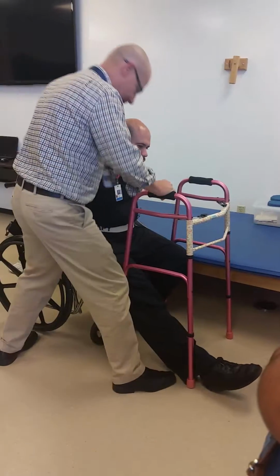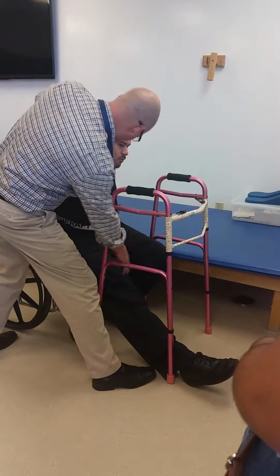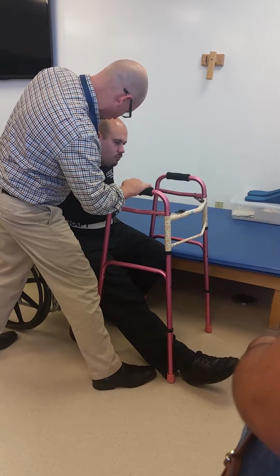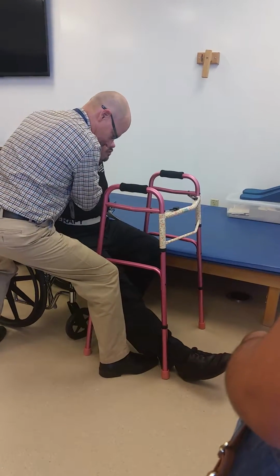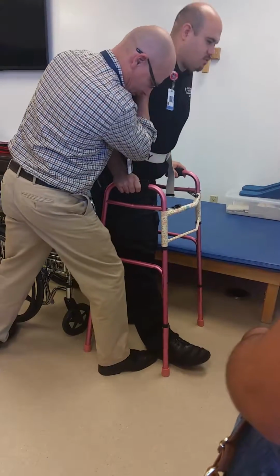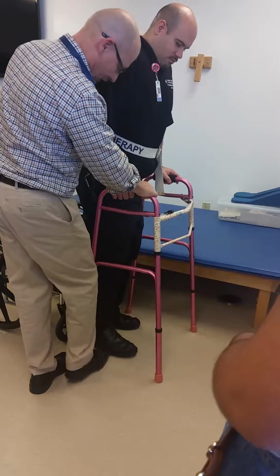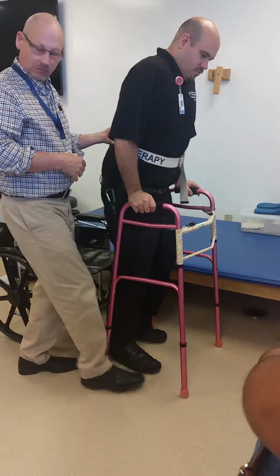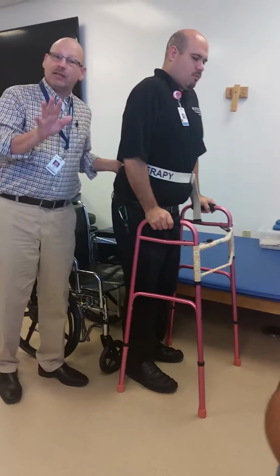I've got a wide base of support. I'm bent low, okay? So on 3, Randy, you're going to lean forward. You're going to stand up, and then you're going to bring this leg underneath you. You're going to put your hands on the walker. You ready? All right, on 3. 1, 2, 3. Good. Bring your leg underneath you. Now, I think I blocked you, didn't I? I blocked you with my foot here. When he went to bring his foot back, I had my foot there, and it kept him from bringing it out. And that's a good point.